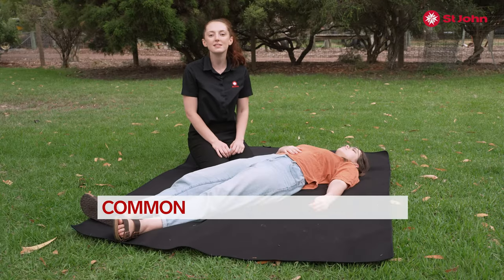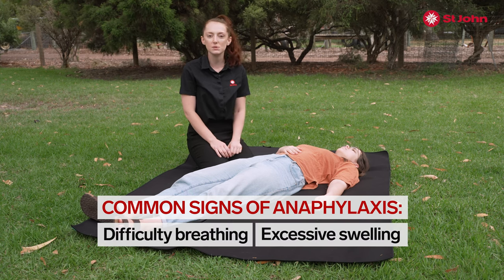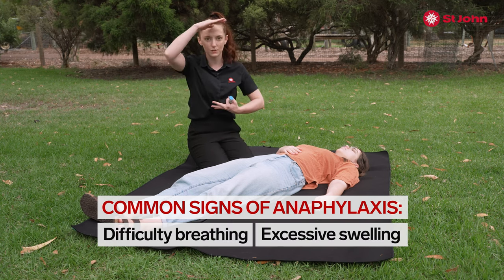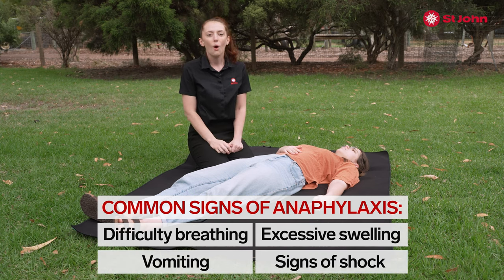Today I'm going to teach you how we administer an EpiPen in the event of an anaphylactic reaction. Common signs and symptoms of anaphylaxis include difficulty breathing, excessive swelling, particularly in this sort of region here, vomiting, and your signs and symptoms of shock. Always follow doctors ABCD.